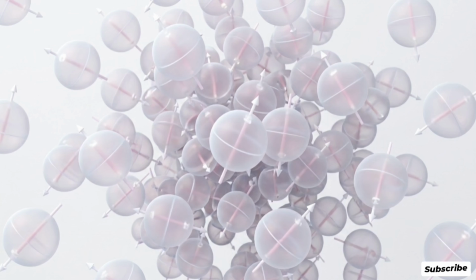In your natural state, you are filled with billions of these tiny magnets, but they are completely disorganized. Their axes point in random chaotic directions, constantly canceling out each other's magnetic pull. This vast chaotic sea of microscopic magnets is the raw material the scanner is about to control.